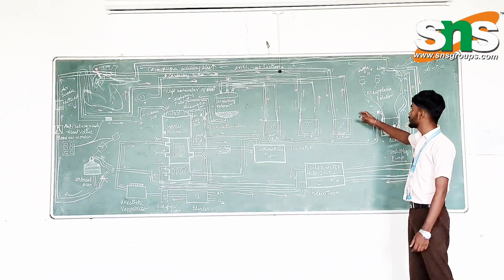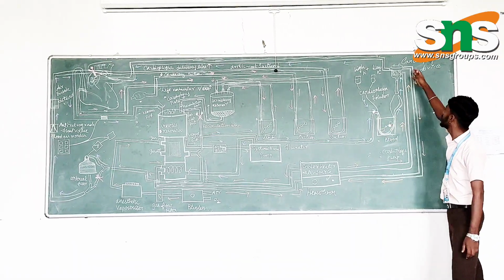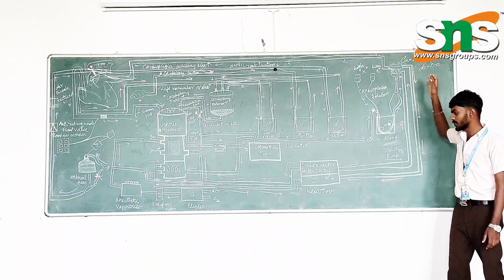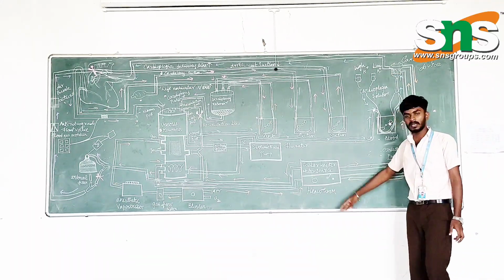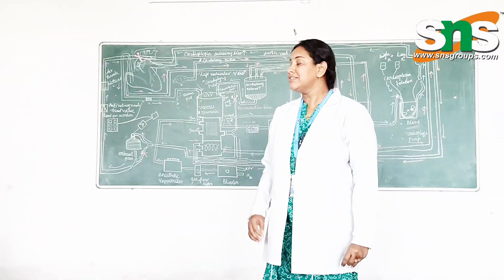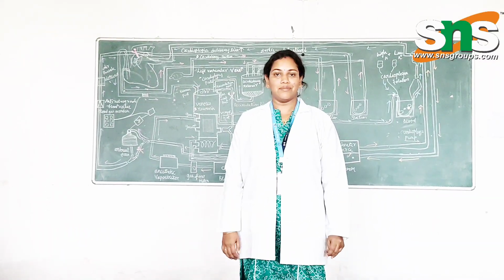The cardioplegia solution and blood mix at the cardioplegia device. The temperature of the cardioplegia device is controlled with the help of the hemotherm, with water entering and leaving. Hence, the perfusionists operate this heart-lung machine.